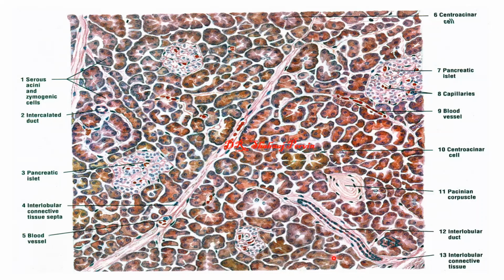It is the tissue of the pancreas. It has the outer capsule. From the capsule send the septum inside and divide the pancreas into different lobes and lobules. Inside the lobes, the content is exocrine part and endocrine part. Exocrine part is what? Pancreatic acinus and duct.